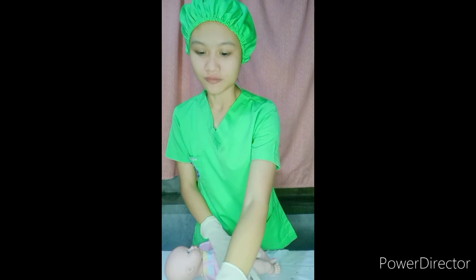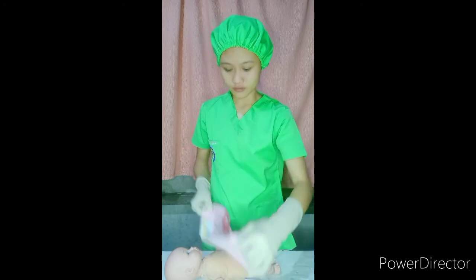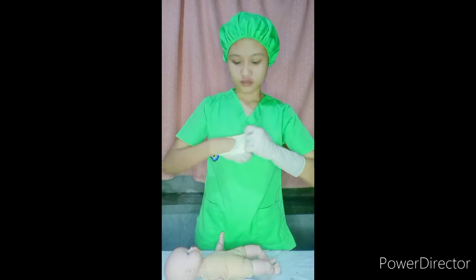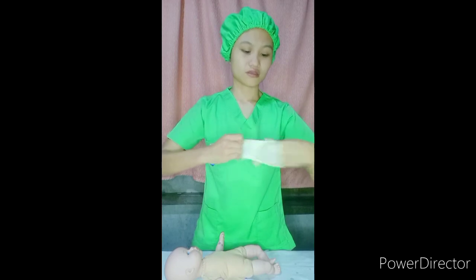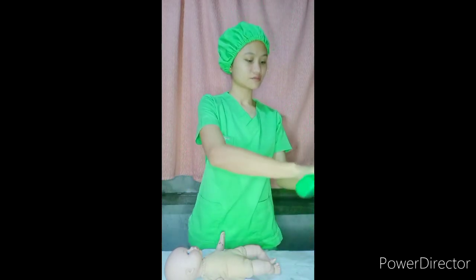Then do not recap the needle. Engage a safety shield or needle guard if present, and dispose the needle and the syringe in the appropriate receptacle. Then assist patient to a position of comfort. Then remove gloves and dispose them properly. Then perform hand hygiene.